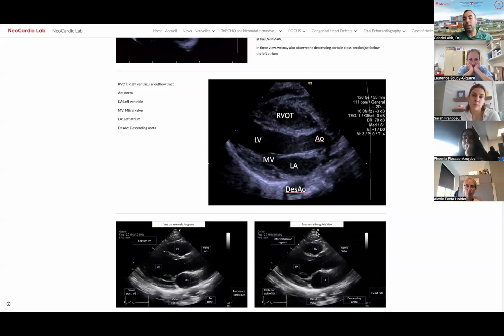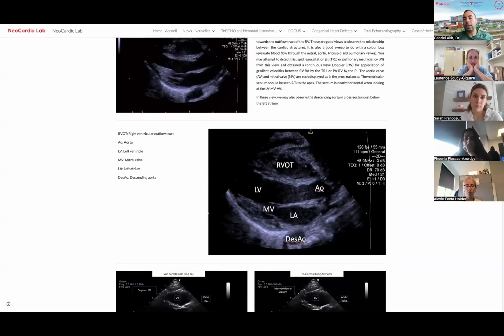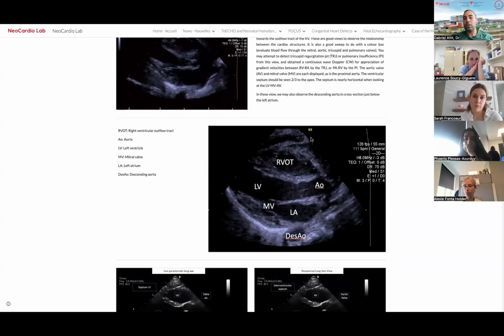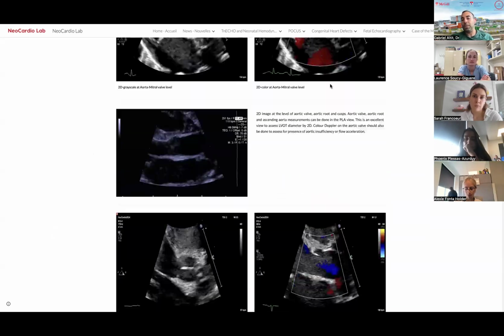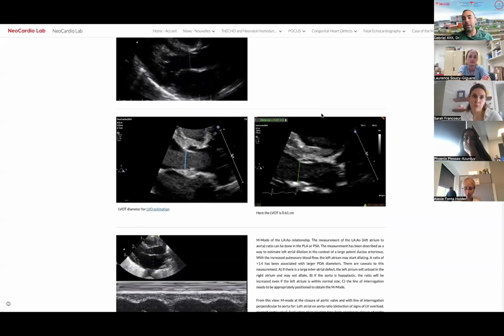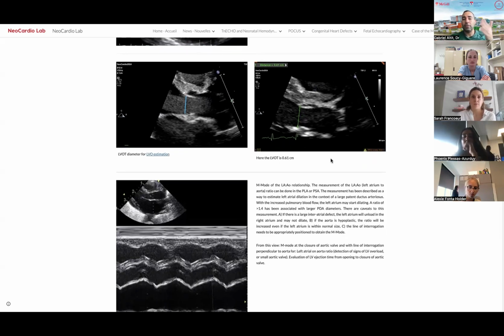So you see left. So V is for GE Vivid. This is like for Siemens or Sequoia. And then P is for Philips. And then B is Butterfly. And if it's an M, it's Mindray. So whichever brand decides to put their little logo, it represents the marker on the actual probe and where it is relative to the anatomy of the patient, okay?